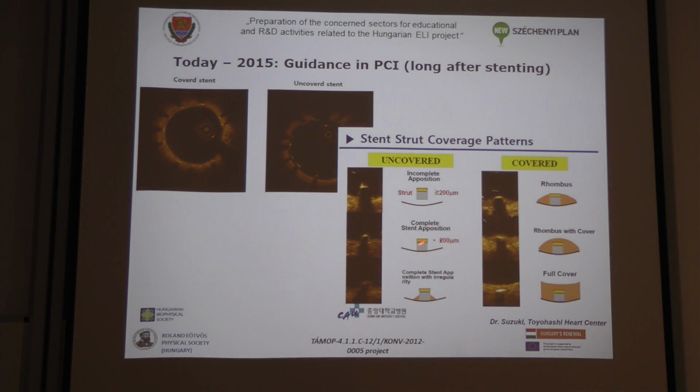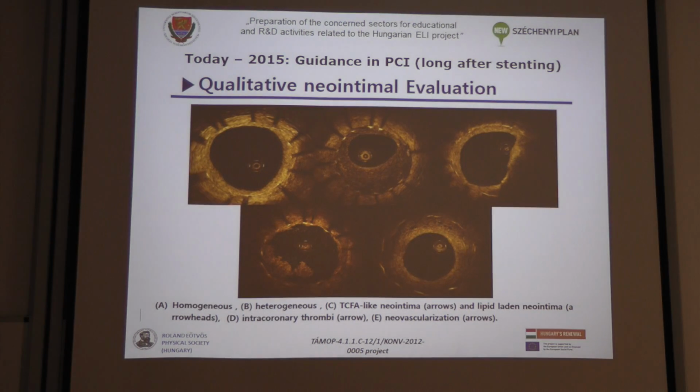There are certain approaches already for how we should measure the extent of the stent apposition, because we can only see the intimal leading edge, the intimal surface of this metallic strut. Also we don't know how much coverage is really needed in the long term.